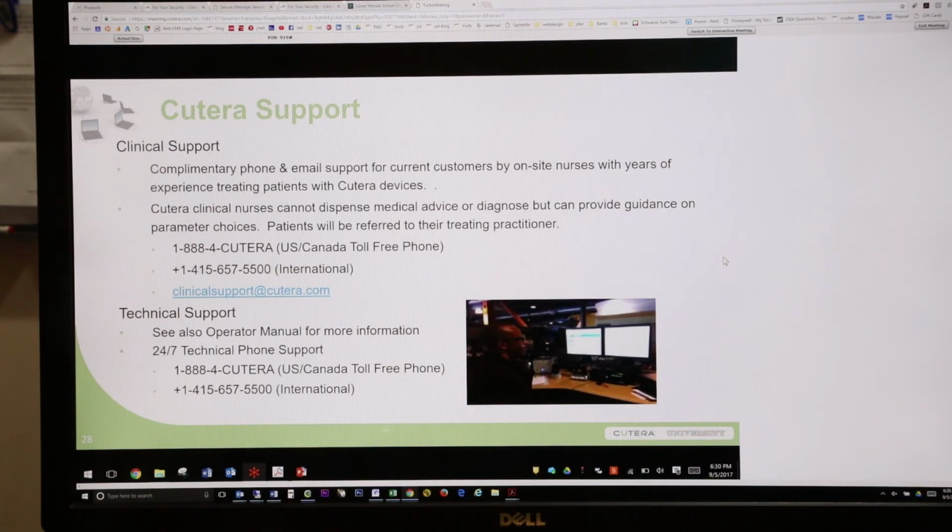There's no question about it because we see sometimes we treat a tattoo, we don't see the tattoo back for another year and the tattoo might be gone or nearly gone just by virtue of the body continuing to break it down. Exactly. I only said that it's 8 weeks because that's the current trend. However, I don't normally practice that because I know that the body will continue to eliminate even if you're not getting repeated treatments.